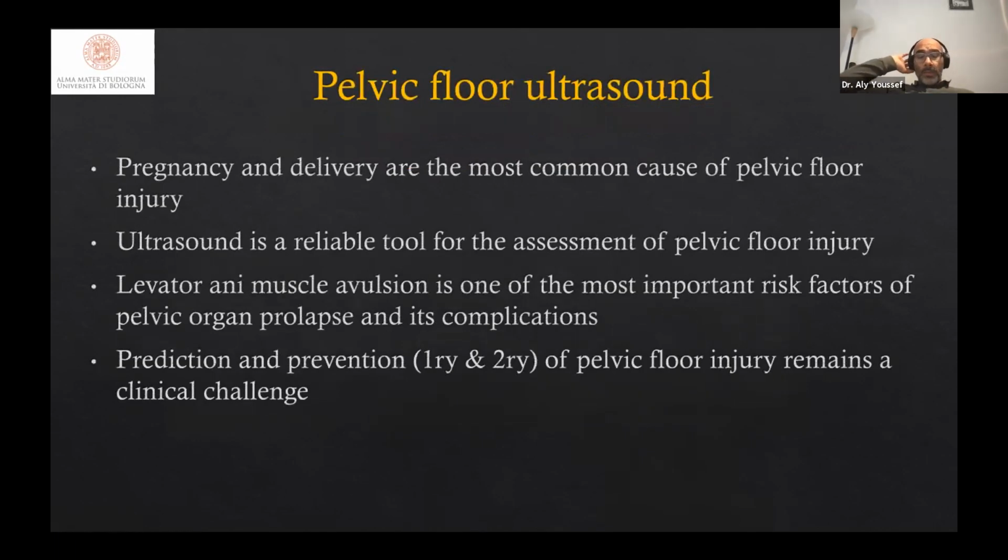So to sum up, the pelvic floor ultrasound is a reproducible and reliable tool to assess the pelvic floor. Transperineal ultrasound can reconstruct and visualize the levator ani muscle. During delivery, an inappropriate relaxation, so levator ani coactivation, is a risk factor for having a prolonged second stage.